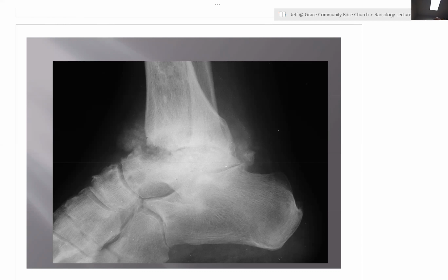I had a case of diffuse idiopathic skeletal hyperostosis that I didn't show you. DISH in the cervical spine, right? And my question was, which of the following are associated with diffuse idiopathic skeletal hyperostosis? You guys know? Diabetes, what else? Why don't you list the possible options? All right, here we go. Number 1 is ossification of the posterior longitudinal ligament, or OPLL. Number 2, osteosarcoma. Number 3, high cholesterol. Number 4, hypermobility. Which of those are associated with diffuse idiopathic skeletal hyperostosis?